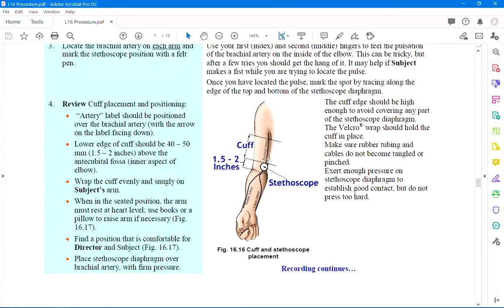Now, very important here as we go to measure the brachial artery, we'll find the brachial artery here. We can palpate that. It's on the interior or inside of the upper arm, just under the belly of the bicep. We'll place the cuff a couple of inches above the bend in the elbow, and then our stethoscope can go directly above the brachial artery.